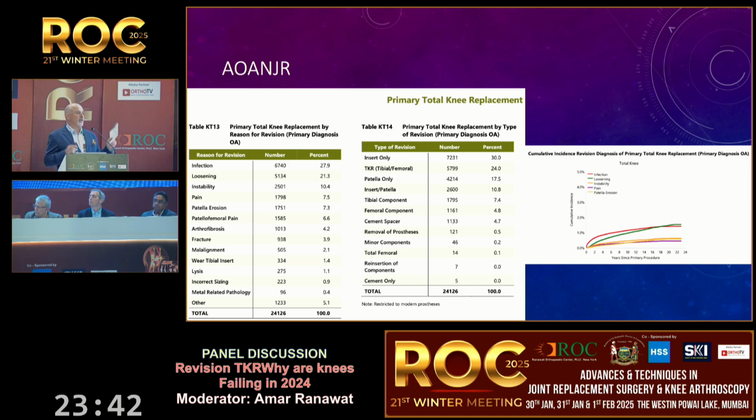So who can give me any more techniques? Do you think the cement that you use matters? The literature says that Palacos is better for the cementing and revision rates are less. One paper has come, but I don't know how much importance I have to give to that. I use Palacos, I use DePuy SmartSet cement, and I use Stryker cement. I have not seen differences over the last 20 years.